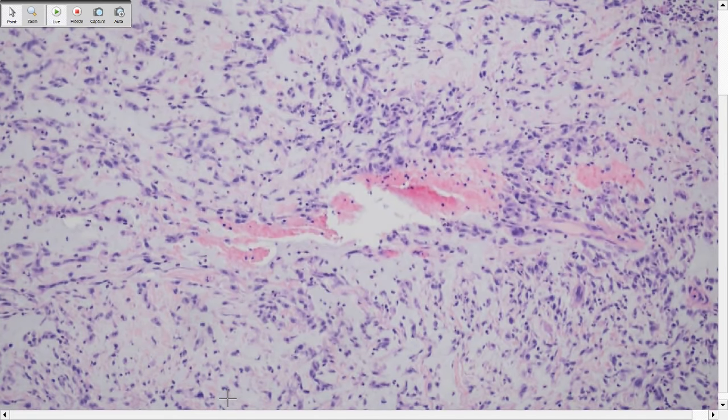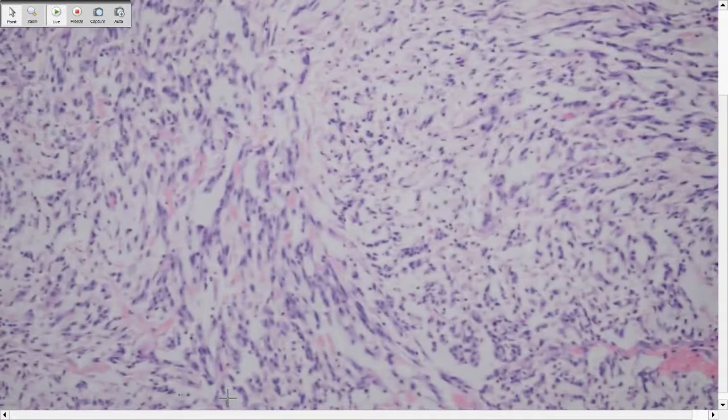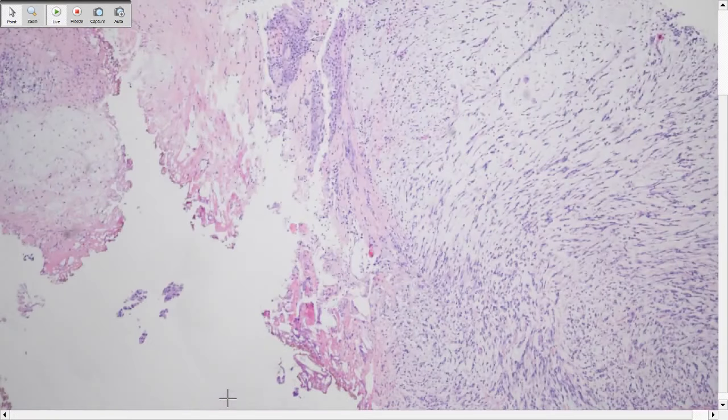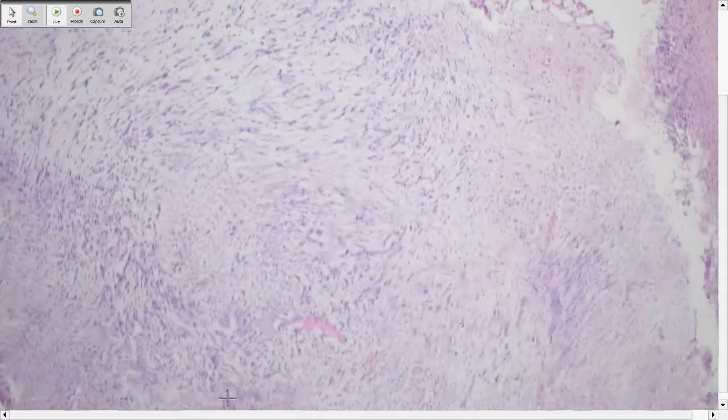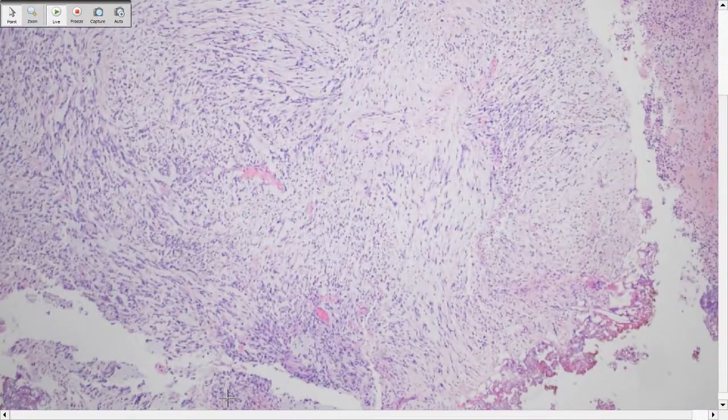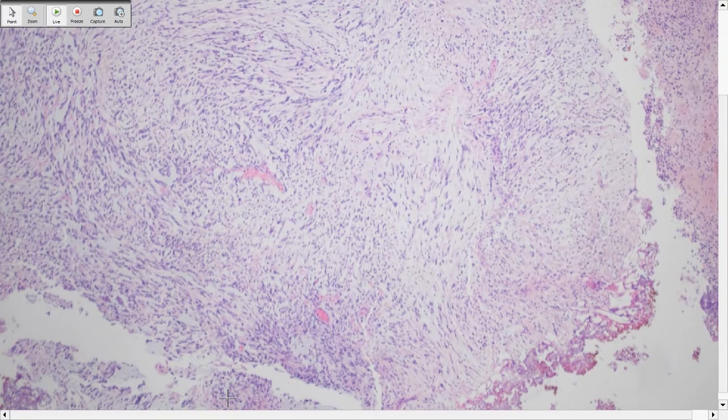Okay, that's the same. We have to call this urothelial carcinoma with sarcomatoid differentiation. Spindle cell, myxoid. In sarcomatoid you can see other components like cartilage, or sometimes rhabdoid, but this one is very myxoid. This is high grade, and we call it high grade urothelial carcinoma with sarcomatoid differentiation. The prognosis would be really bad.